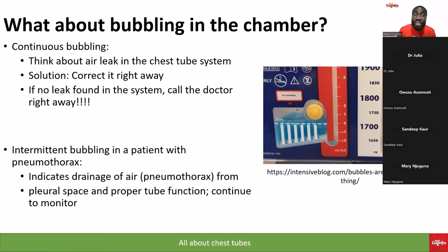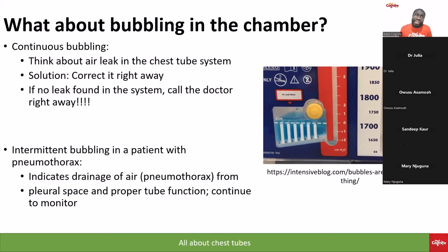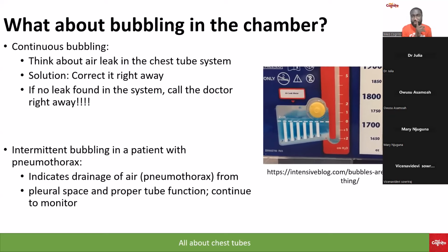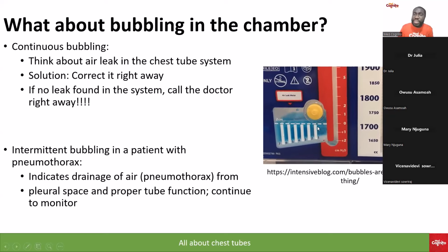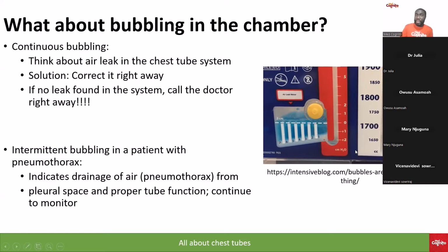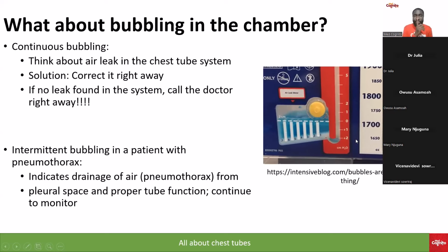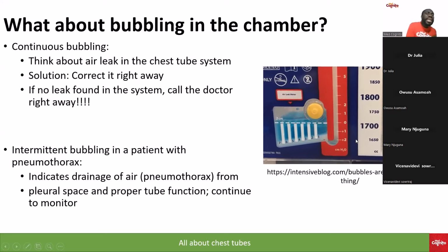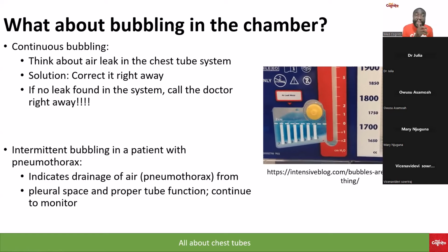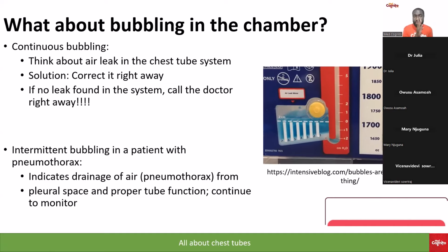That is not very good. If there's continuous bubbling, think about air leakage in the chest tube system. If there's air leakage, you want to correct it right away. But if you check the whole system and there is no leakage, then you need to call a doctor right away.